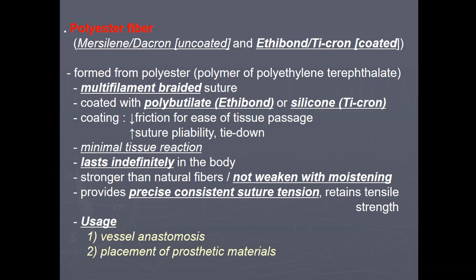So the coating's advantage is decreased friction for ease of tissue passage and increased suture pliability. Minimal tissue reaction, lasts indefinitely in the body, stronger than natural fiber, and usages are vessel anastomosis and placement of prosthetic materials.